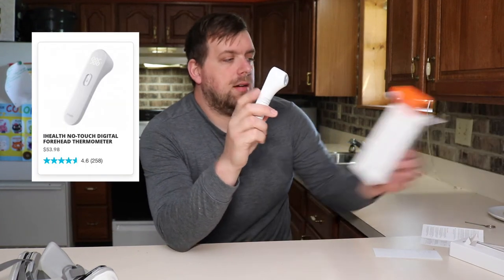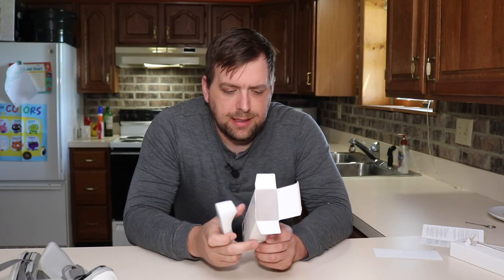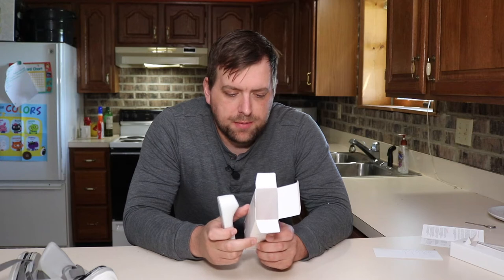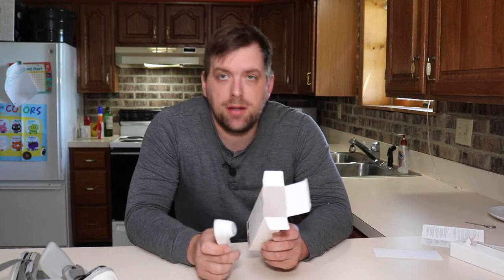As a response to this pandemic, they are offering on their website a no-touch thermometer that on the box says it is quick and easy, higher accuracy, equipped with the most advanced medical infrared technology for accuracy and reliability.